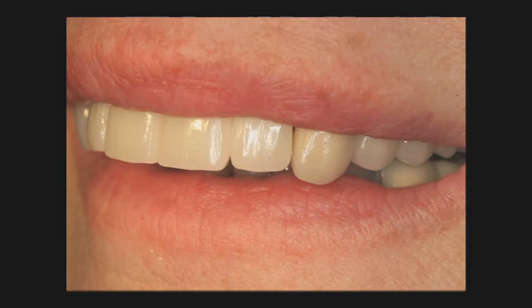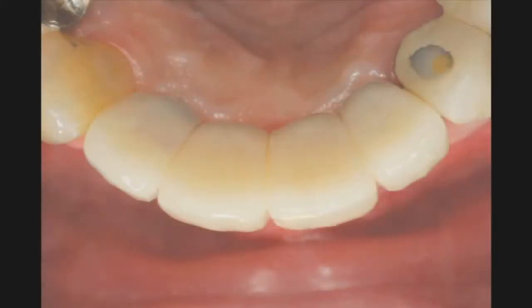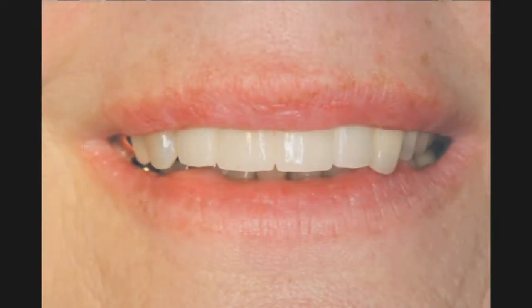You can see right and left smile, and we do have some issues of the maxillary left posterior area. That was an old bridge that isn't very aesthetic. The laboratory did something for me very special that I'll demonstrate in a second. Occlusal view of the bridge in place, and a smile. Immediately following implant placement, we put in temporary abutments, and we loaded a transitional bridge. However, if you did not feel comfortable with that, we could have taken a step back, put the custom milled healing abutments in, and relined her flipper and let her wear that in a more conventional method.